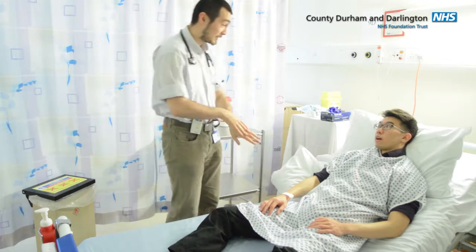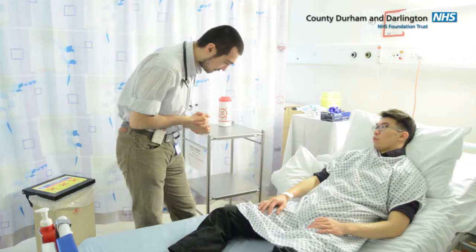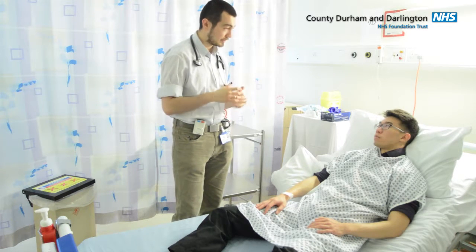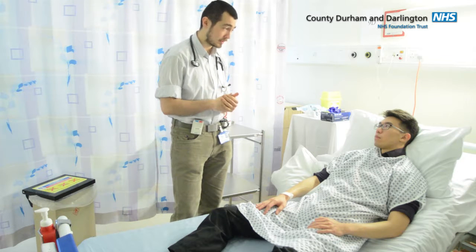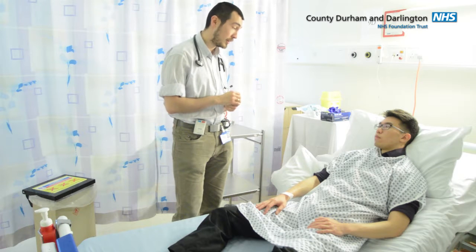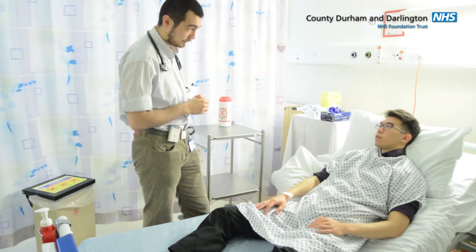Hello there, sir. My name is Alexei. I'm a junior doctor here. Can I just confirm your full name and date of birth? That's Louis, and my date of birth is the 1/1/66. Excellent. Well, it's very nice to meet you, sir. Now, today I understand that you've come in with a bit of a cough and a fever. Is that right? Yeah. Now, because of that, I've spoken to one of my microbiology colleagues, and they've recommended that we take a bit of a blood test from your arm, so we can grow a bug that could be causing all of your symptoms. Would that be something okay with you? Yeah, that's fine by me.